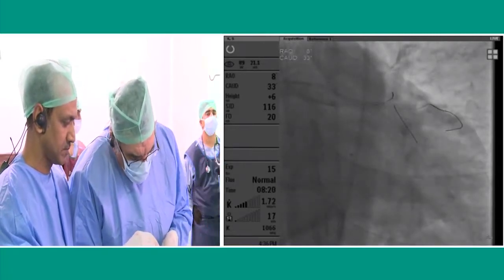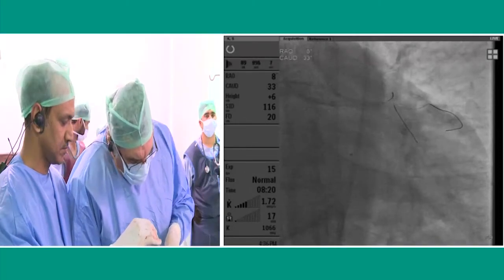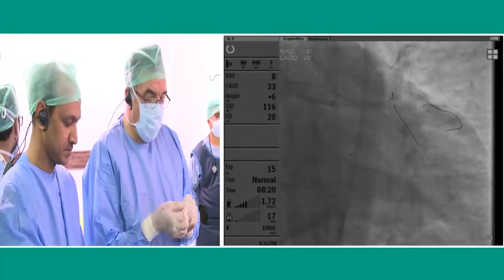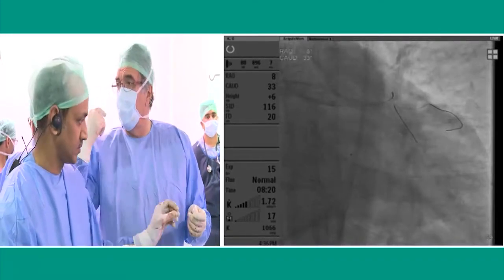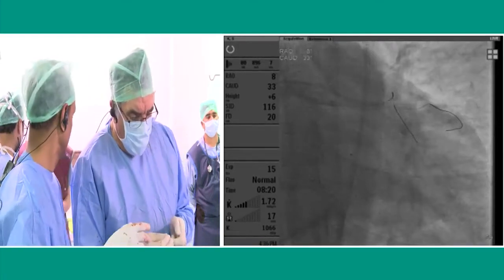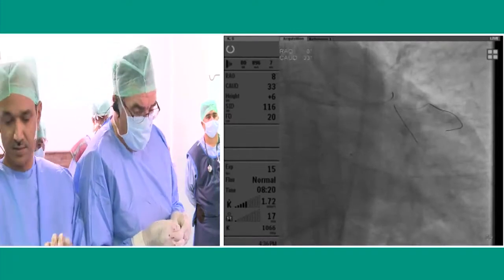In a case like this, will IVUS or OCT help you or guide you? There is a problem with the procedure. John? I'm sorry, I cannot hear you. The sound is too high. Can we reduce the volume of the sound, please? Will you do IVUS or OCT to guide? Give me a 3.5 balloon. A 3.5 balloon. Yeah.